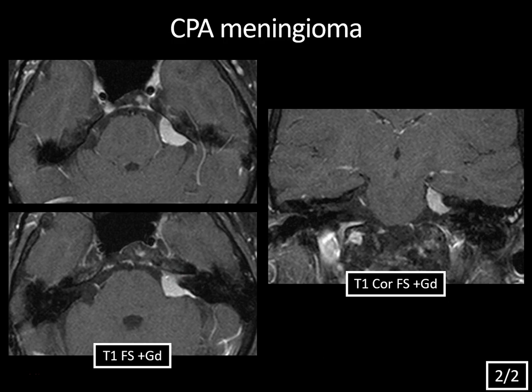Instead of forming an acute angle with the adjacent dura, you can see there's more of an obtuse angle here. Just like with schwannomas, if meningiomas are multiple, you would think about neurofibromatosis type 2. Also, occasionally you can get hyperostosis or erosion of the underlying bone with meningiomas.